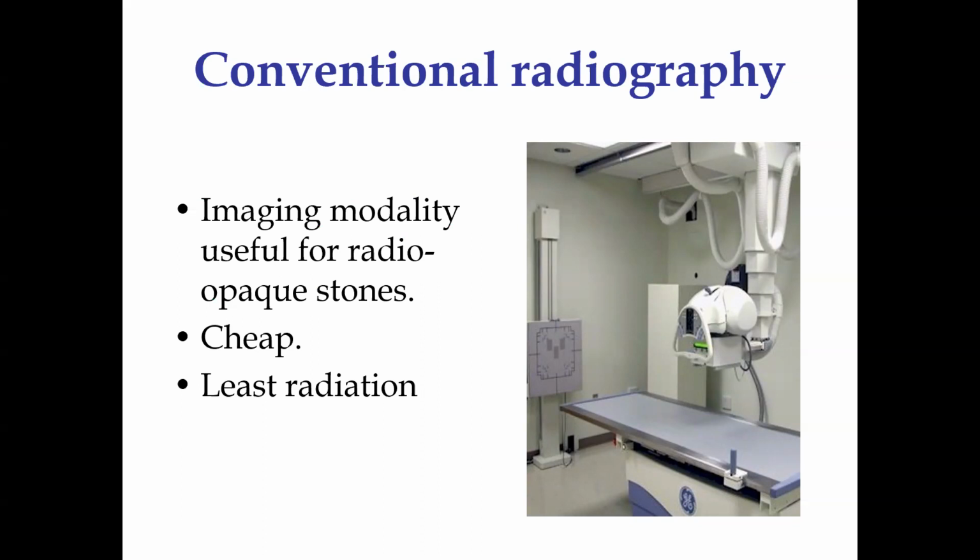Okay, not visible. Agree. So I'm asking about the percentage. Out of say 100% or 10 stones, how many would be visible on X-rays? All 10. 90%. Okay. So that is why we are still using these X-rays. If they were not visible, we would have left X-rays long ago. Since 9 out of 10 are still visible, that is why we are still using X-rays.